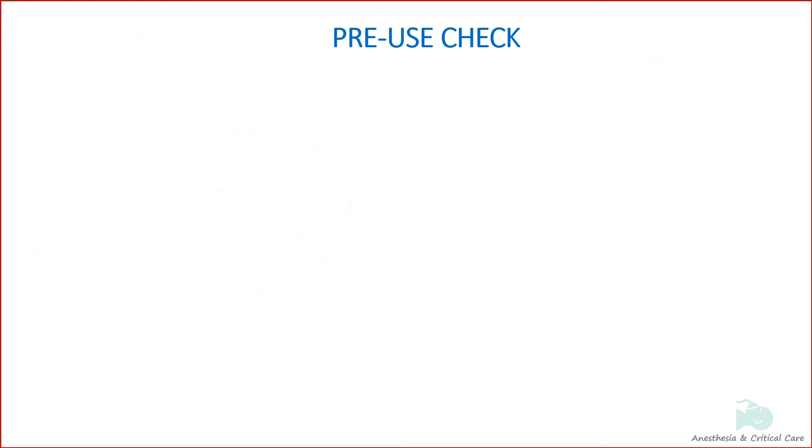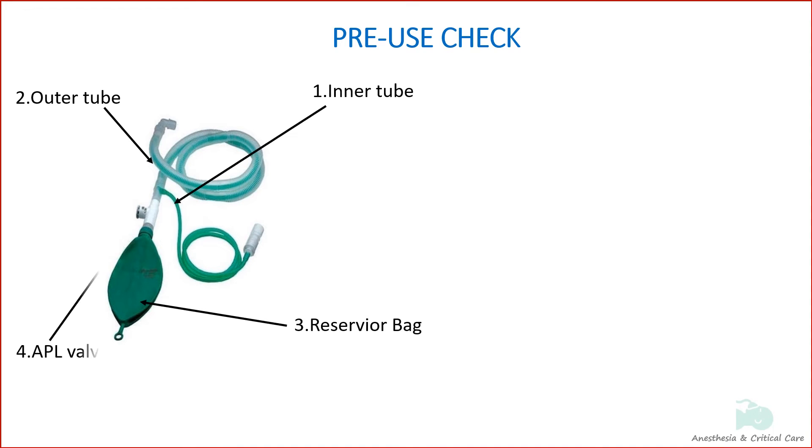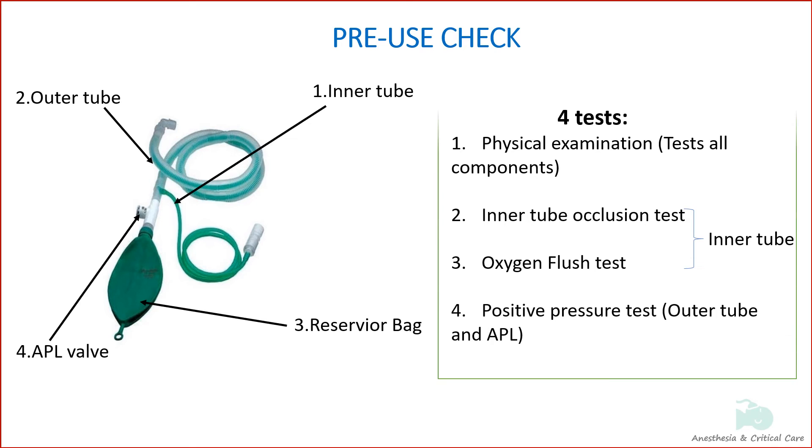The pre-use check for the Bain circuit involves checking the structural and functional integrity of the inner tube, outer tube, reservoir bag, and APL valve. There are four important examinations: physical examination, inner tube occlusion test, oxygen flush test for the inner tube, and positive pressure test for the outer tube and APL valve.